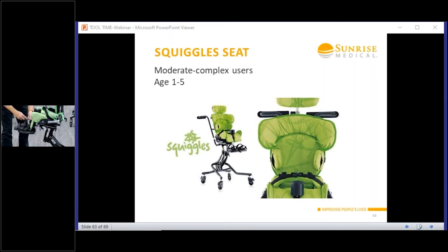And then we also have lower leg, which Robbie's showing you now. Simple Allen key. She's going to give that all round adjustment. So really, Rob's just taken a really teeny tiny chair, perhaps for a 1-year-old, and converted it for a 4 or 5-year-old. Okay.